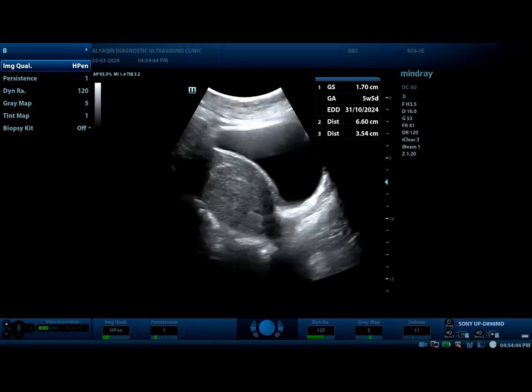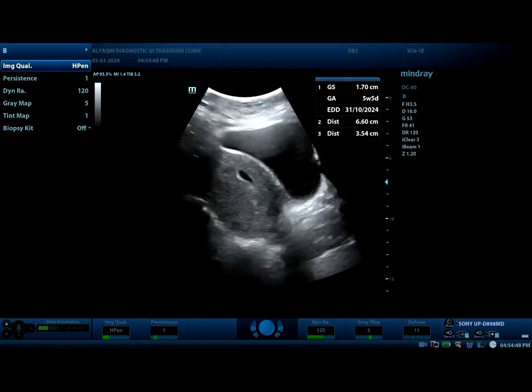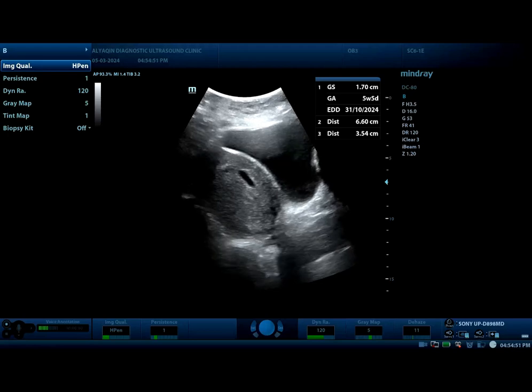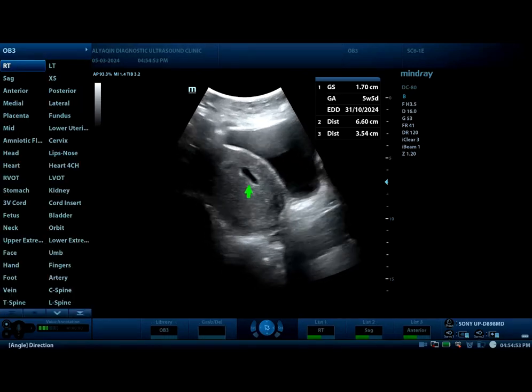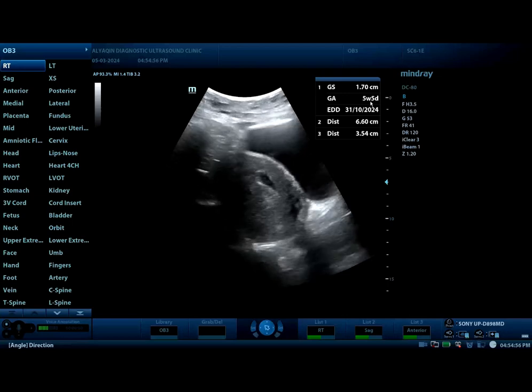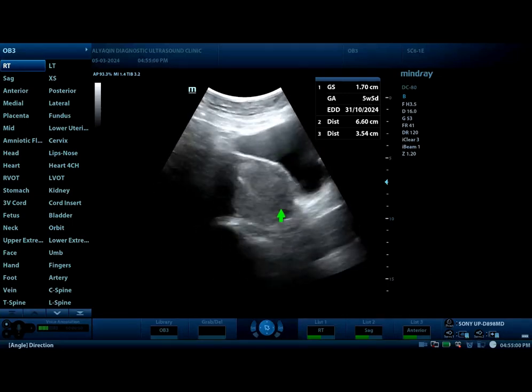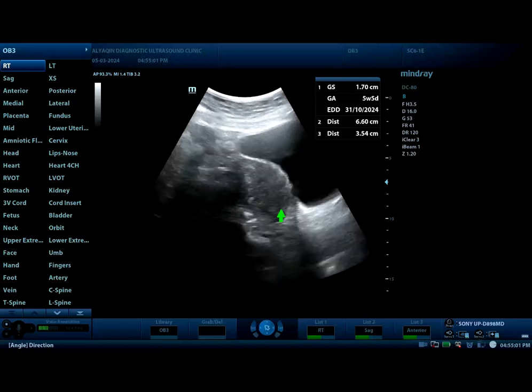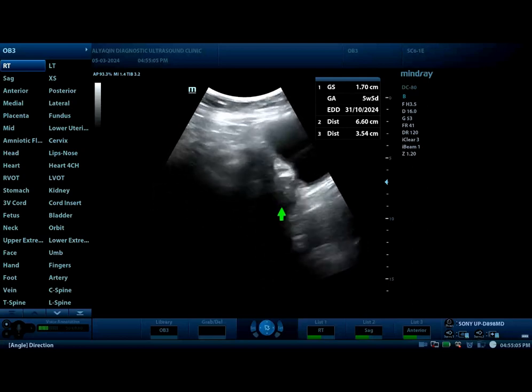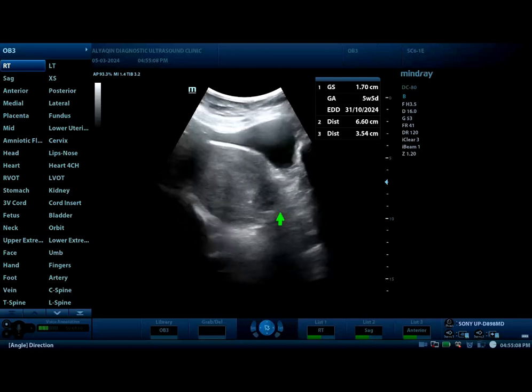This is a first trimester routine obstetrical ultrasound. There is a small gestational sac and this is an early pregnancy of approximately five weeks. Tilting the probe to the left, this is the left ovary.